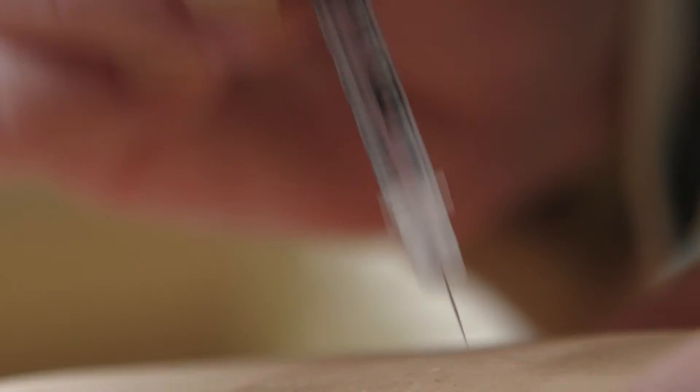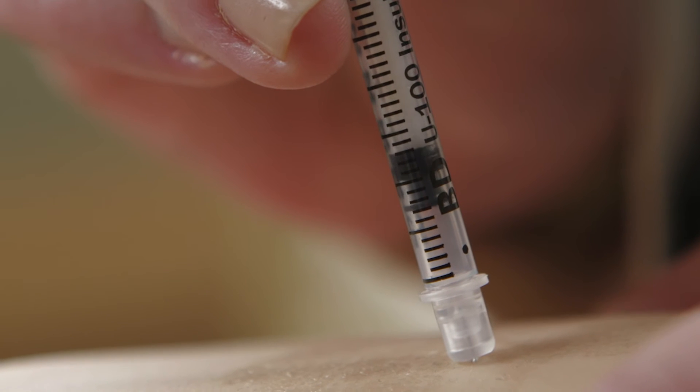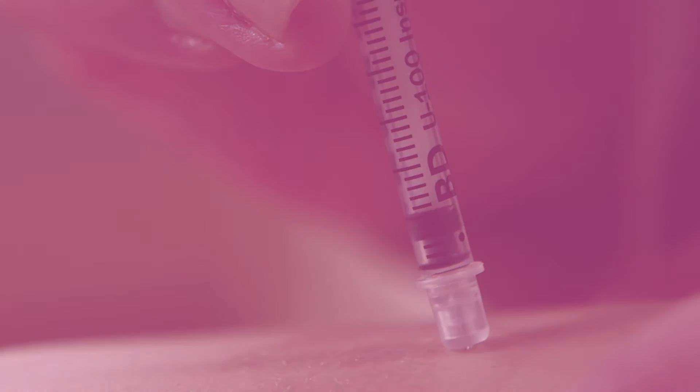Administer the mini-dose glucagon by pinching up the skin. Inject the needle at a 45 to 90 degree angle.